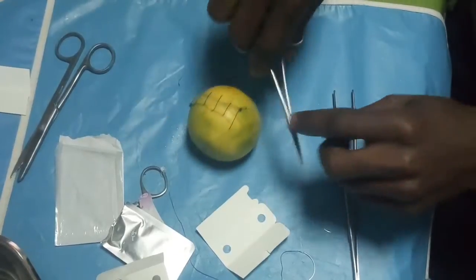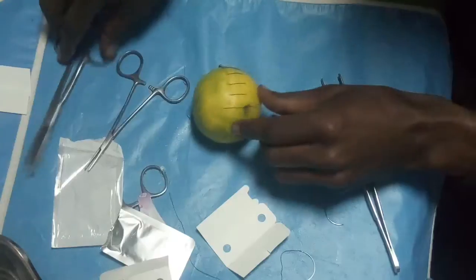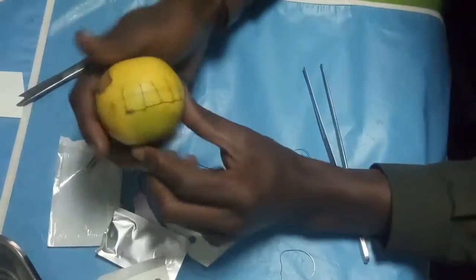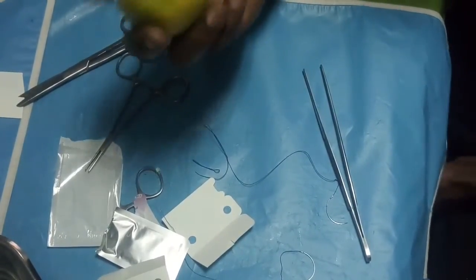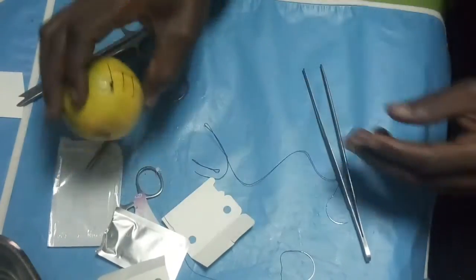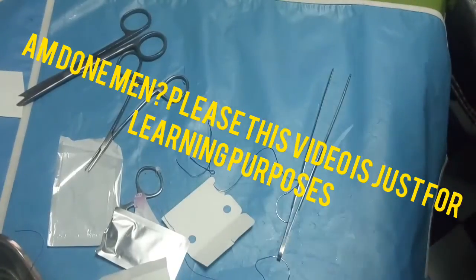And the last one, 1. Use your scissors to make sure that you have left a neat pattern. Now we make the second stage of the interlocking pattern in deep tissue injuries of the muscle.